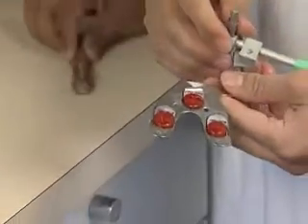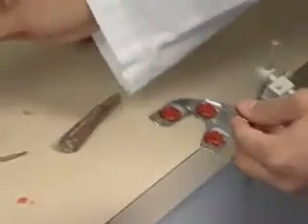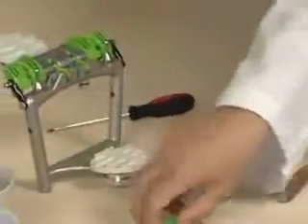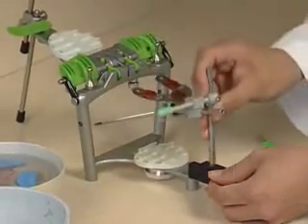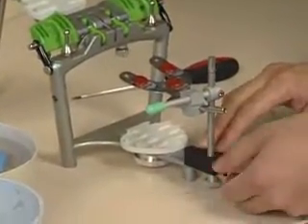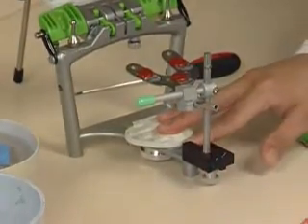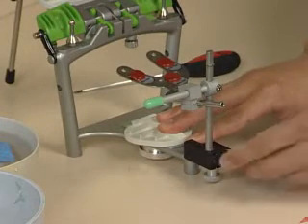Okay. And now then he'll put the bite fork assembly onto the articulator. Be sure and put the flat side toward the screw in the front. Notice how when he did the final tightening, how it centered the bite fork.